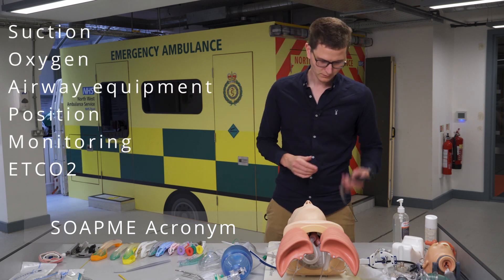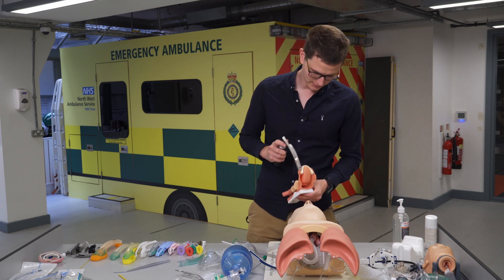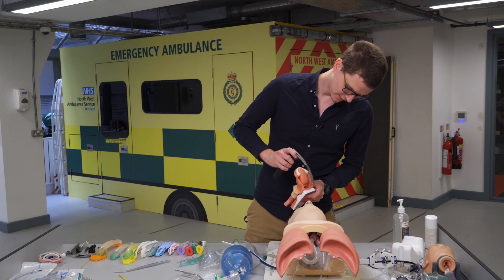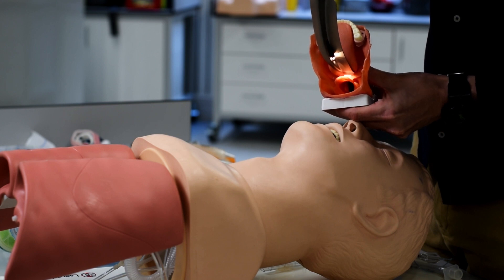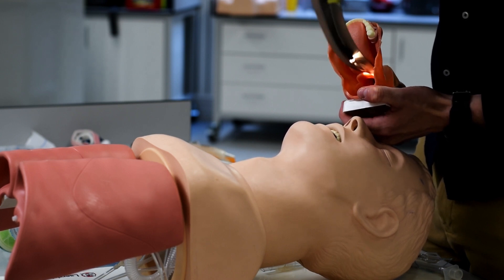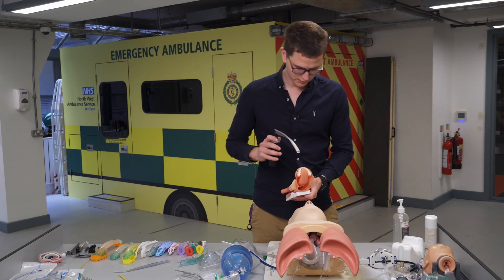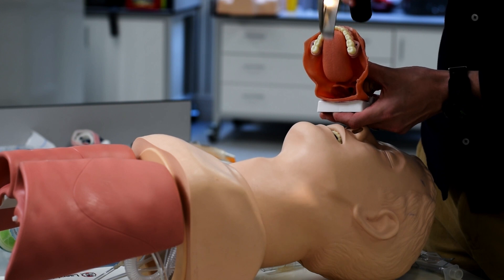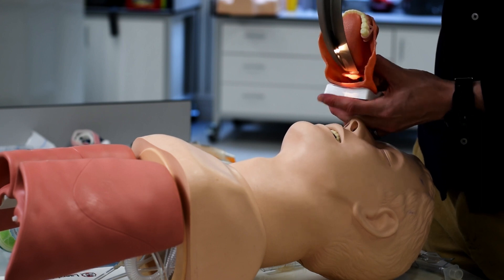The blade goes in your left hand. It comes down the right-hand side of the patient, and you scoop the tongue — the tip of the blade needs to go into the vallecula, which is the space between the tongue and the epiglottis. Then you pull up to improve the view. There are two approaches: either go down slowly lifting as you go until you find your spot, or go all the way in deep and lift out slowly until you find the vallecula and epiglottis.